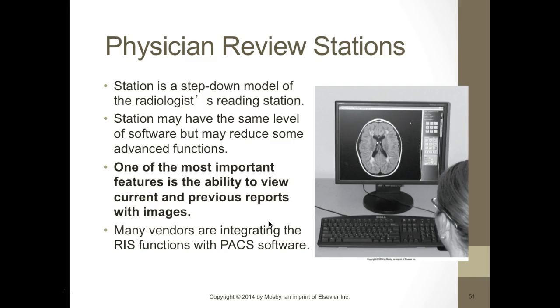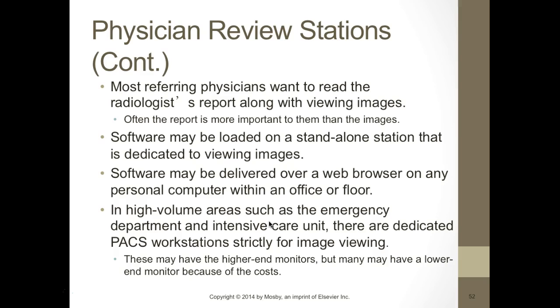So one of the most important features is the ability to view current and previous reports. So we want to make sure that they can click on the report while they're looking at the images. Most referring physicians want to read the radiologist's report. Software may be loaded on a standalone station that is dedicated to viewing images. Software may also be delivered over a web browser to any personal computer within the office or floor.